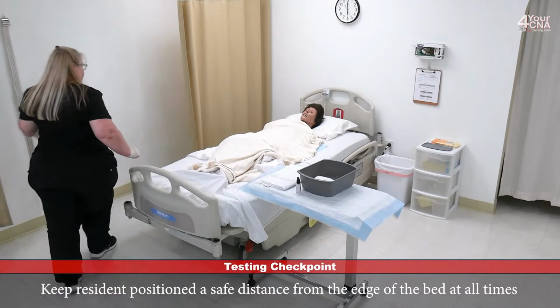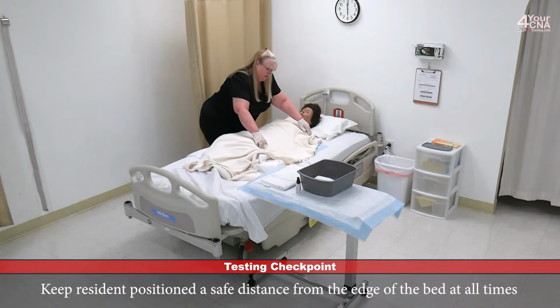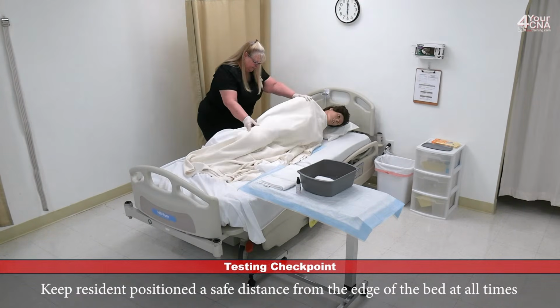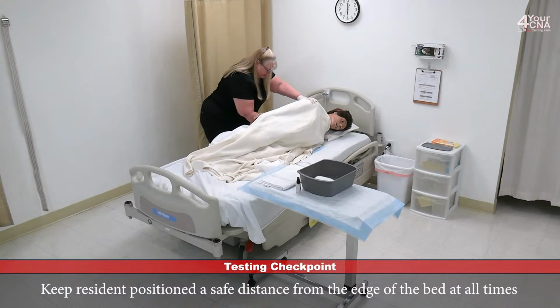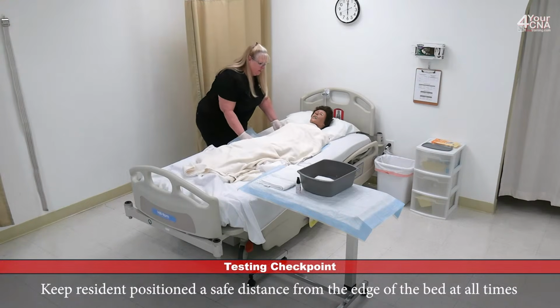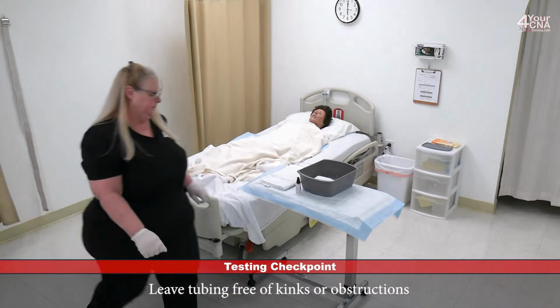Okay, Miss Jones, we're going to repeat the process. Go ahead and scoot toward me. And we're going to roll you onto your left side. 1, 2, 3. And I'll smooth that chux out underneath the patient. Come on back onto your back. And then scoot to the middle. Now we can begin the cleaning.